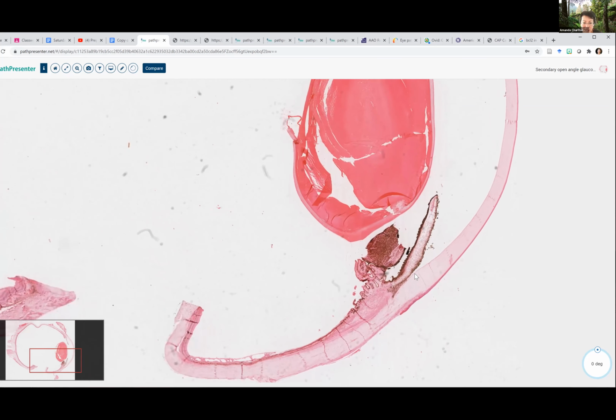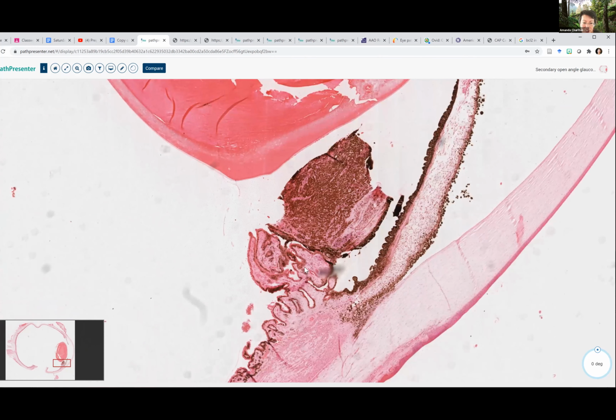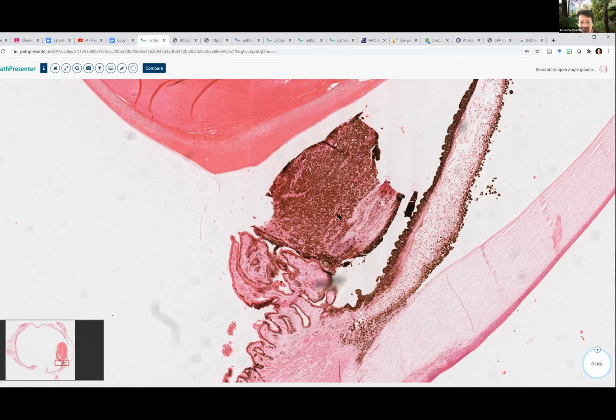Looking at this, we have some hyalinization in the ciliary processes, so I think this is most likely to be an adult. This tumor seems to be detached. The section is probably not quite right, but I think it's associated with ciliary body pigment epithelium. And this is a tumor expanding the ciliary body. It's brown pigmented. Better go have a close look in here.